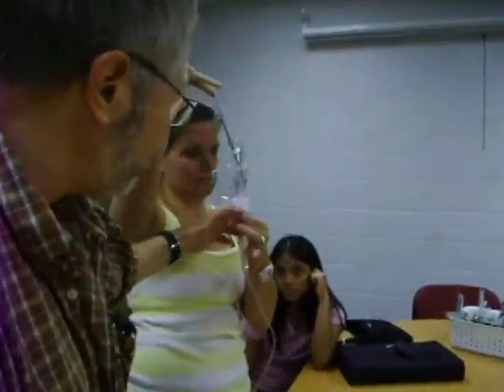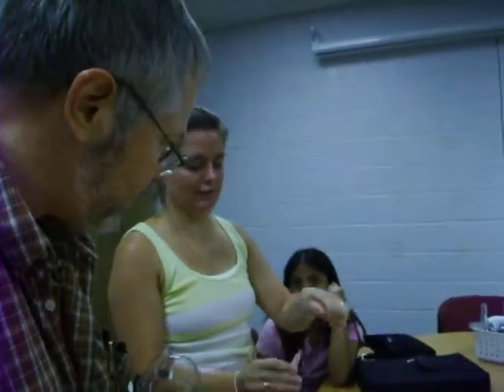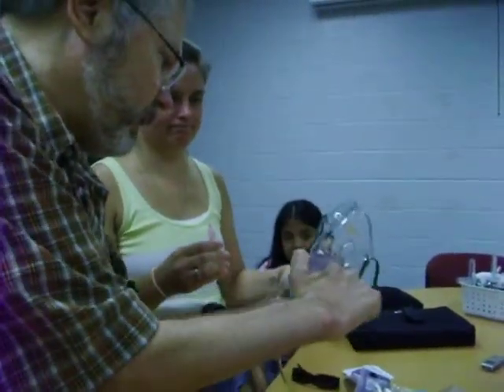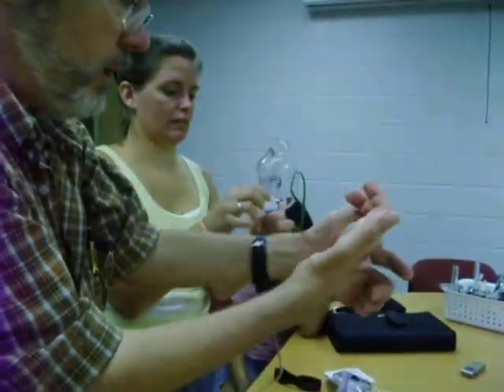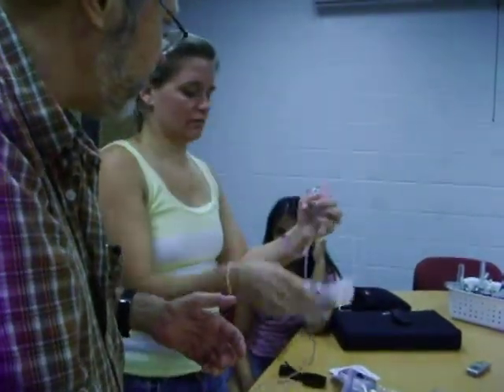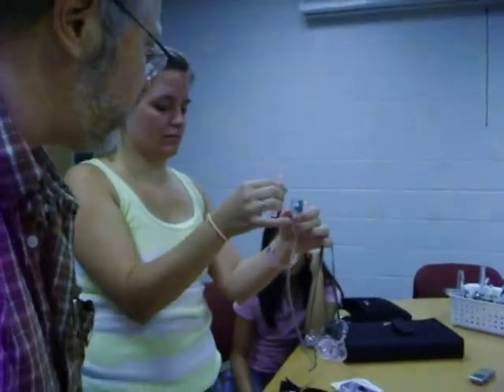The next thing I do is hold it in one hand and break the cap off — snap it, you twist. You're going to open this. The way you do it is you open it and then hold the other piece in your hand in a sterile sort of way. That's okay — that works, just as long as that doesn't touch anything.